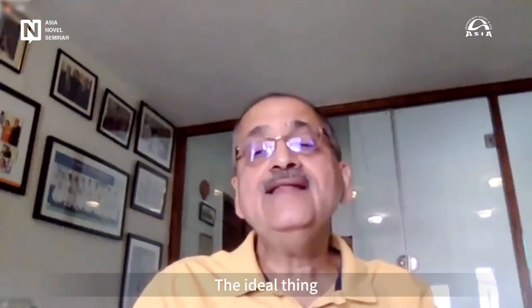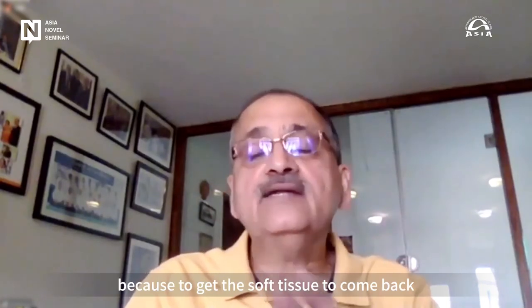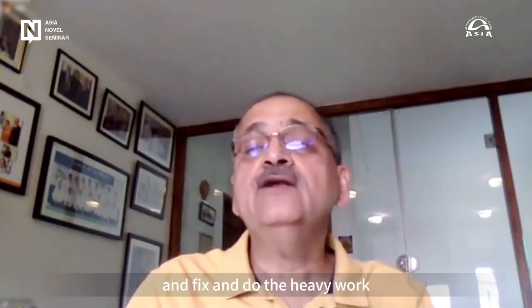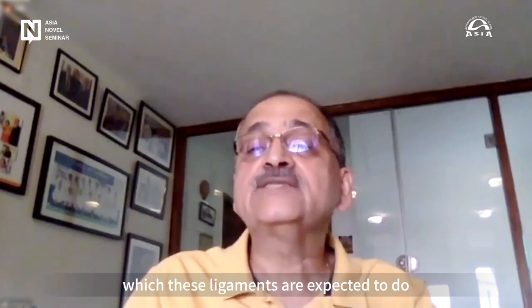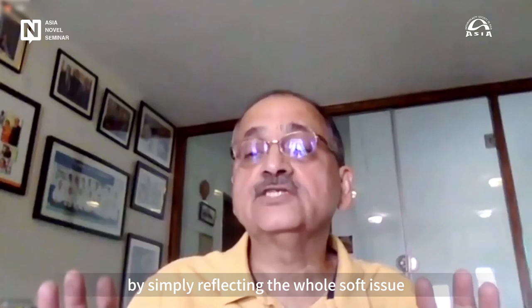No, your ideal thing will be to take a bit of bone sliver with it, because to get the soft tissue to come back and fix and do the heavy work which these ligaments are expected to do will not be possible by simply reflecting the whole soft tissue.